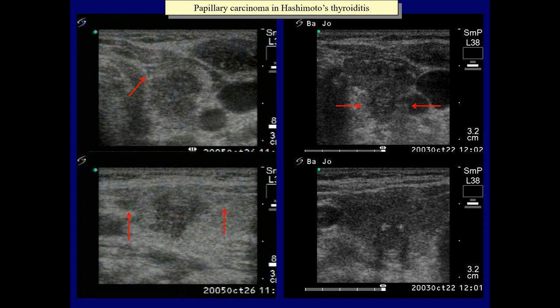These are partly microcalcifications. The lower longitudinal scan proves that coarse calcification must also be present, because of the two acoustic shadows.